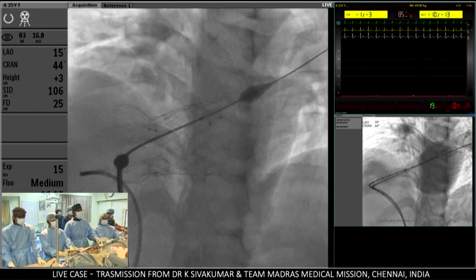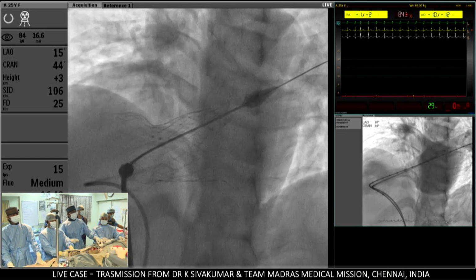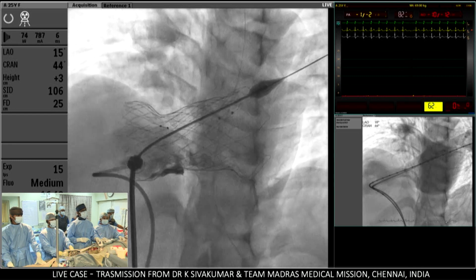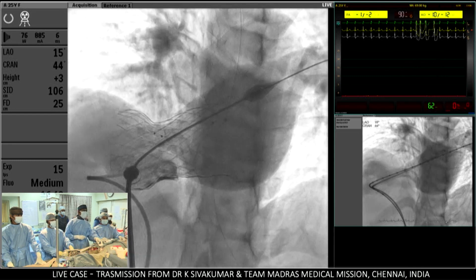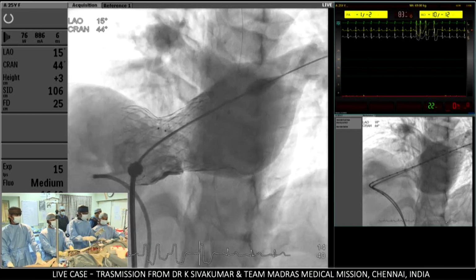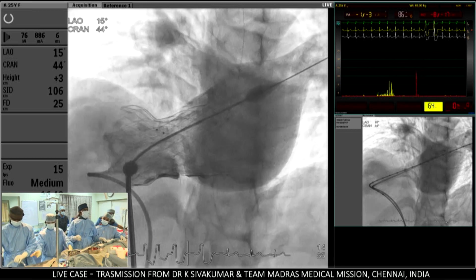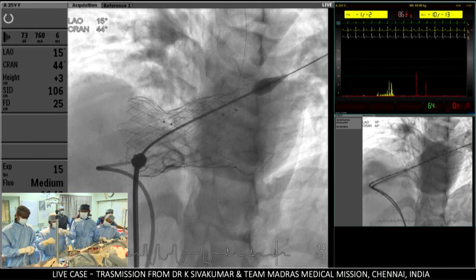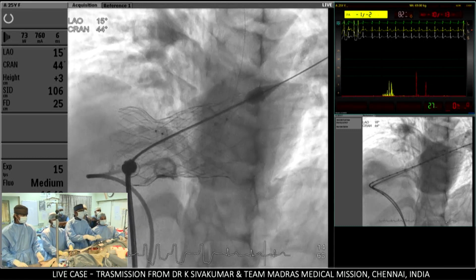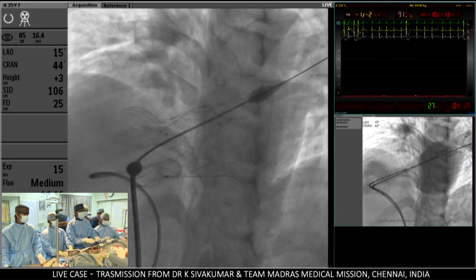Position it. Actually, my catheter is to some extent in the right ventricular side. I will take it out later, but I will make one angiogram. Shoot. Okay. The valve seems to be in a good position. It is indeed, yes. I will now wiggle out first the pigtail catheter, which has got trapped between the valve and the wall of the right ventricle.